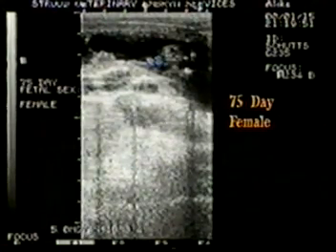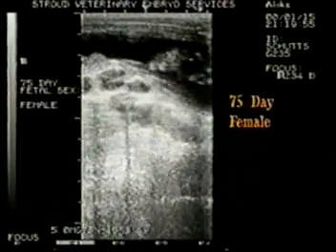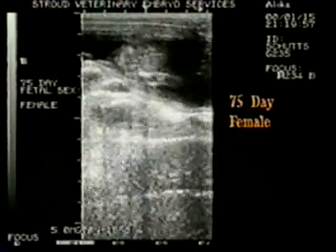Again, the distinct bilobe blue highlighted structure is the female GT. Closely follow the tail in this sequence to delineate it from the female GT.